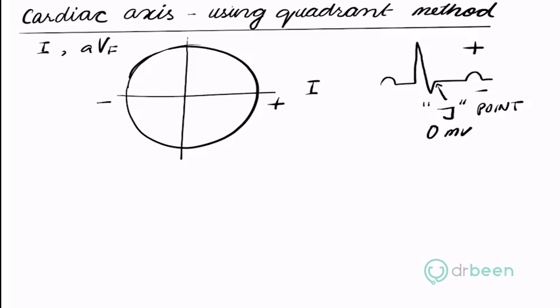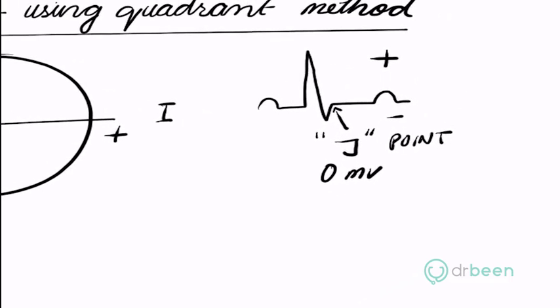So with that in mind, if you look at the QRS complex here, I'm going to make it a little bigger. This one is the R wave, and you can obviously see that this R wave is much bigger than the S wave here. However, we can also do a calculation, and for that we need to have the ECG boxes drawn here. So let me just draw a few boxes.